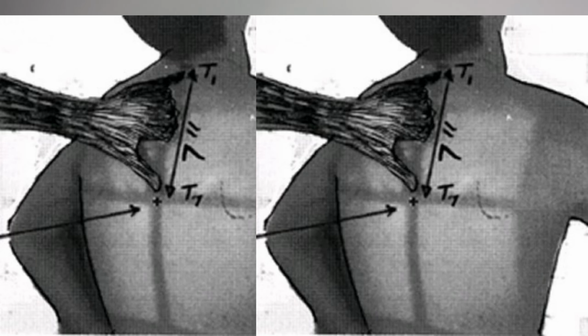Okay, and how do you ensure that? You ensure that by centering. It's important to make sure that you know your centering points. I know with chest, this technique is famous. So your thumb will be at the tip of your neck, down below your neck. And then this one will be in the center of your chest or lung.